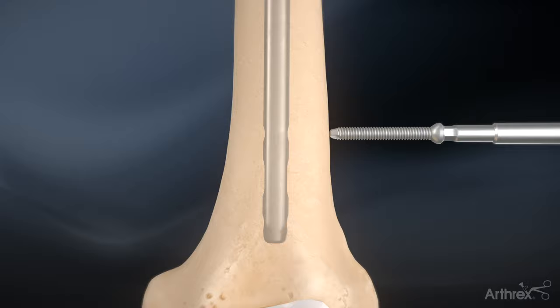Insert a distal 5 mm cortical screw using the hex driver to complete the nail fixation.